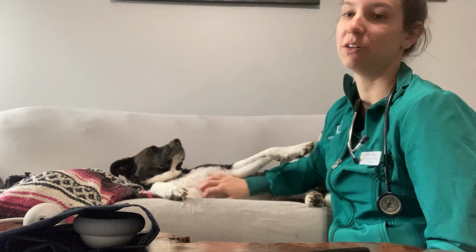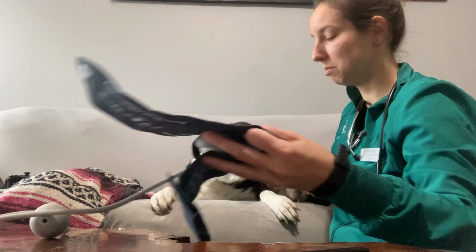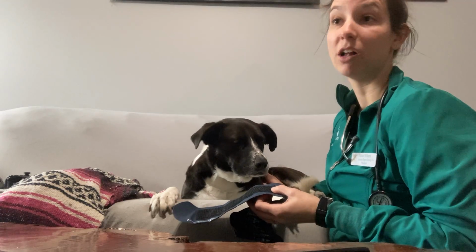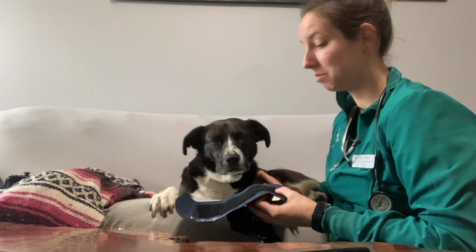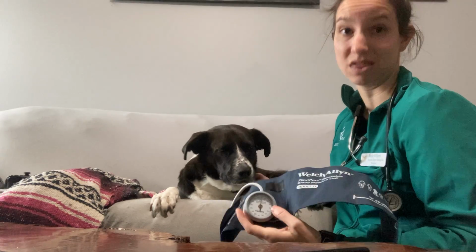But my final vital is going to be my blood pressure. Now, I do have my blood pressure cuff here. Sadie has seen this cuff before, but we have established that Sadie is not the biggest fan and does not care for it on an arm of hers. I have my alternate lab assistant, the pesky red Floof. She's asleep on the stone floor, and I am not going to disturb her at this time. Also, she's quite squirrely. They don't like it when I put this thing on them. It also does not fit them.